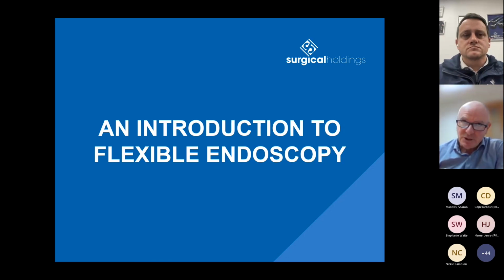I don't think we're at that stage yet with endoscopic imaging technology. The difference between standard definition and high definition was huge, and then the difference between high definition and 4K was big. But I don't believe that's going to continue to happen in a linear fashion. It will certainly level off.